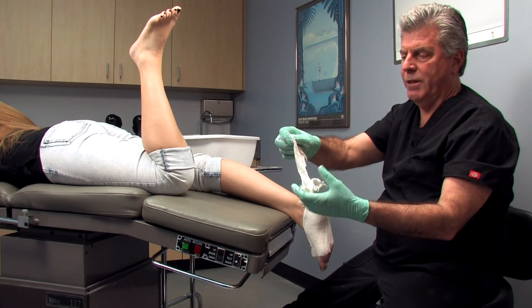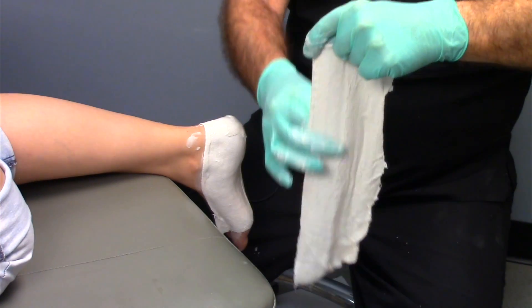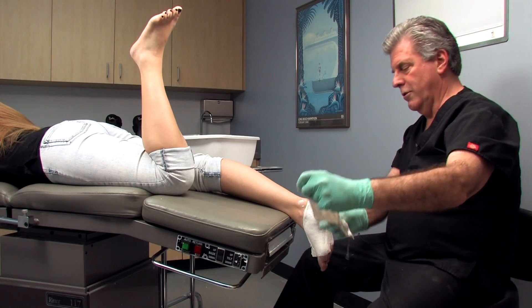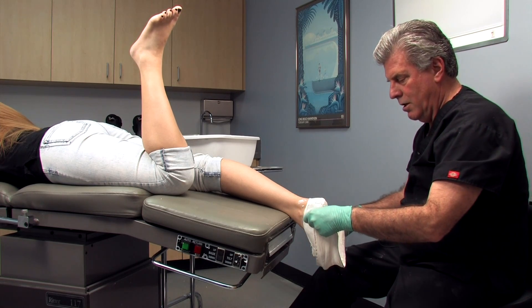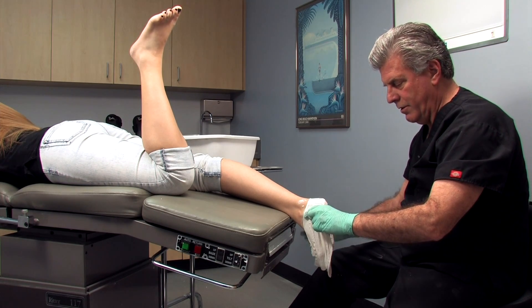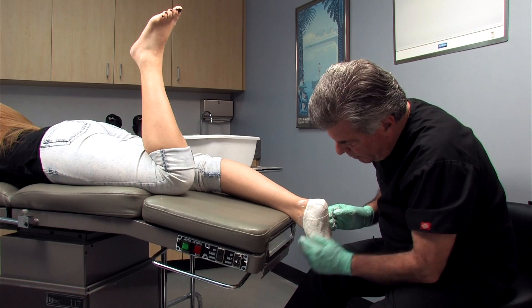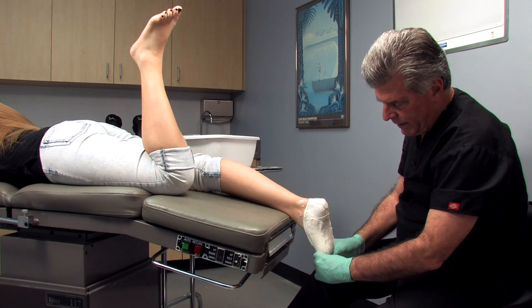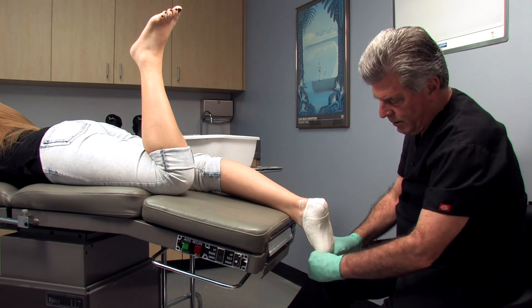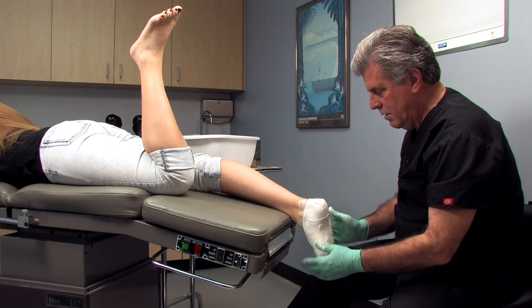We take our second piece, which has already been dipped in water and is curing at the same rate as the first piece, so we end up with one cast. Again, we smooth it in. This one is a little more tricky — we bring it up on the foot, starting lateral and molding it into the toes and into the sulcus. Then we bring the final flap from medial. We smooth everything in and bring all extra plaster into the sulcus, just like we did with the supine technique. No bunching or wrinkling — we really want to get that metatarsal impression accurate.